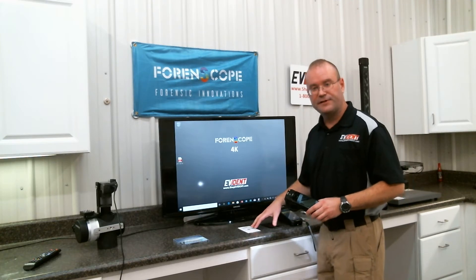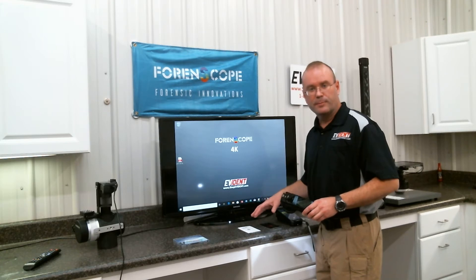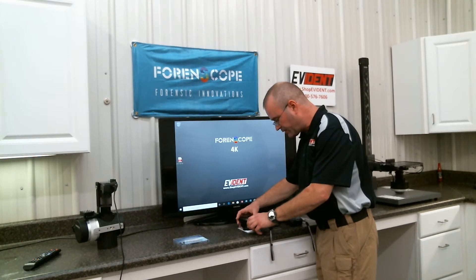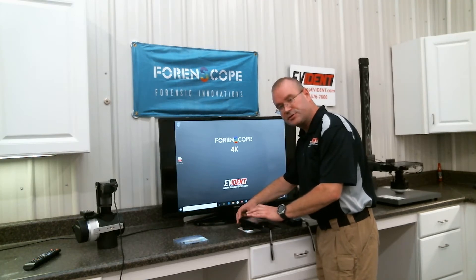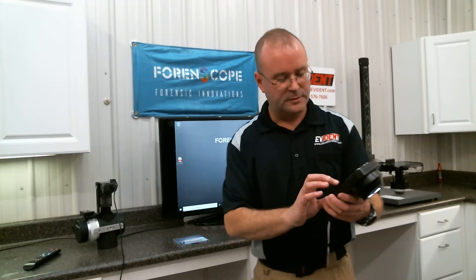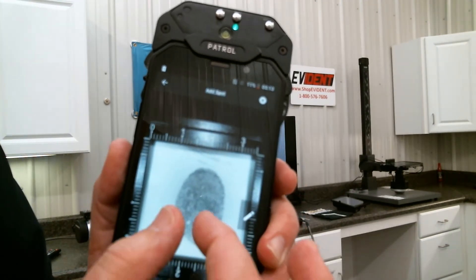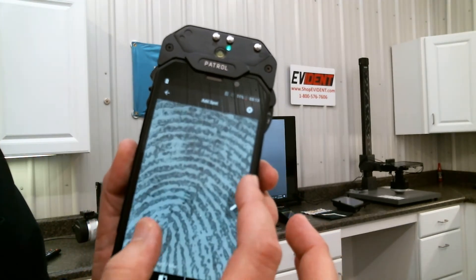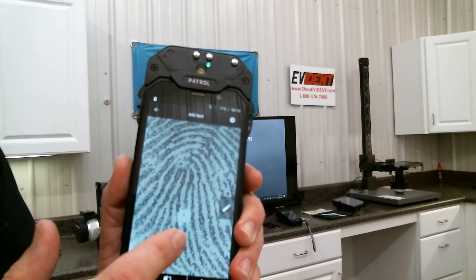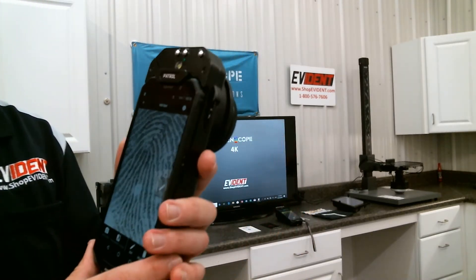I've got a latent fingerprint here. We can imagine that it's either at the scene or back at the office at the laboratory. I simply set the device over top of the fingerprint, tap the screen to focus, and touch the shutter button. This is the image that I just captured that quickly. Very highly detailed image. High resolution. Captured all the level 3 detail. It's a really great device. Easy, easy, easy to use.